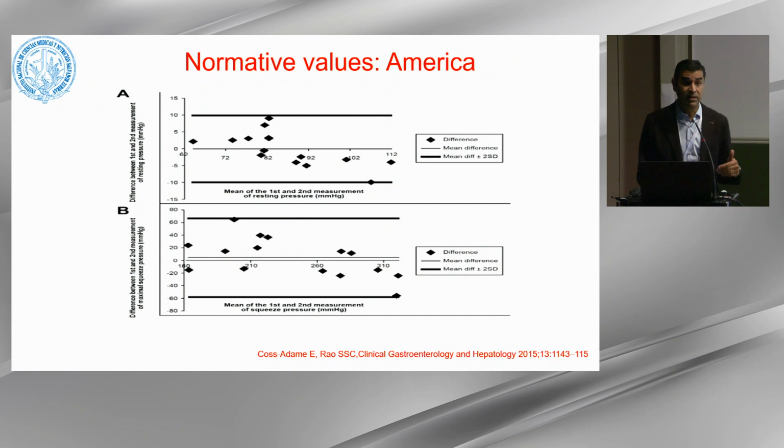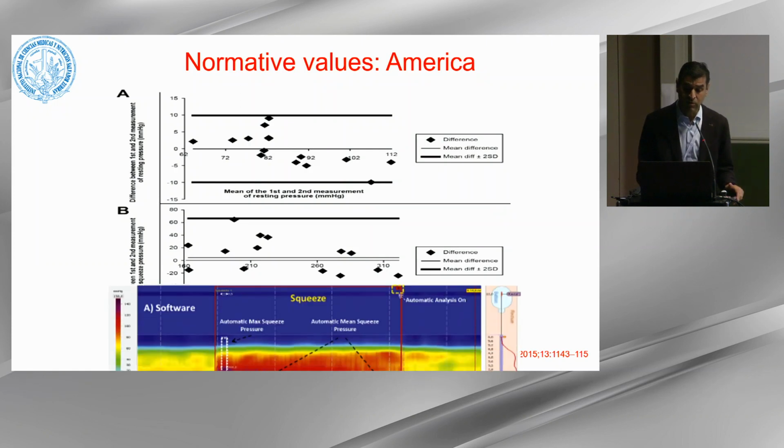We did this study in a repeat fashion in a subset of patients, and we found that the pressure acquisition was similar at the different times that we acquired those values. So that means that this technique gives us reproducibility and fidelity of the data that we acquired.